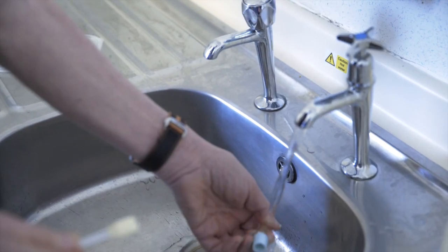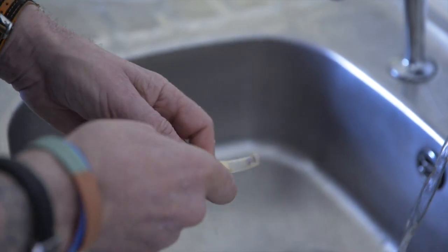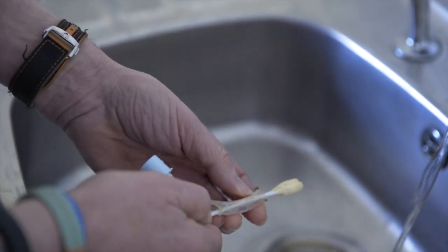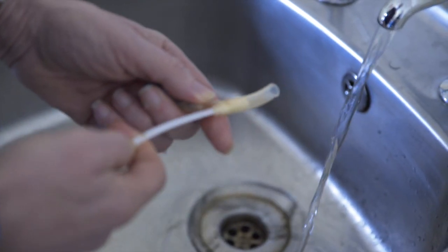You can wash the inner tube with water and the cleaning swabs to remove any mucus and crusting from the inner tube. Once the tube is cleaned, this is reusable.